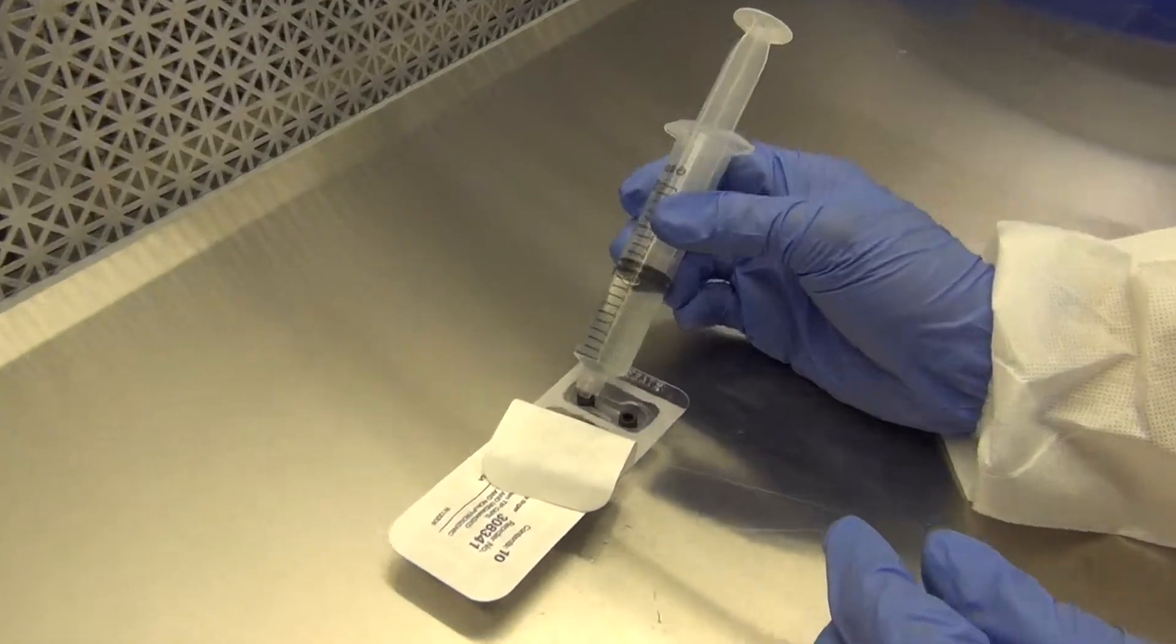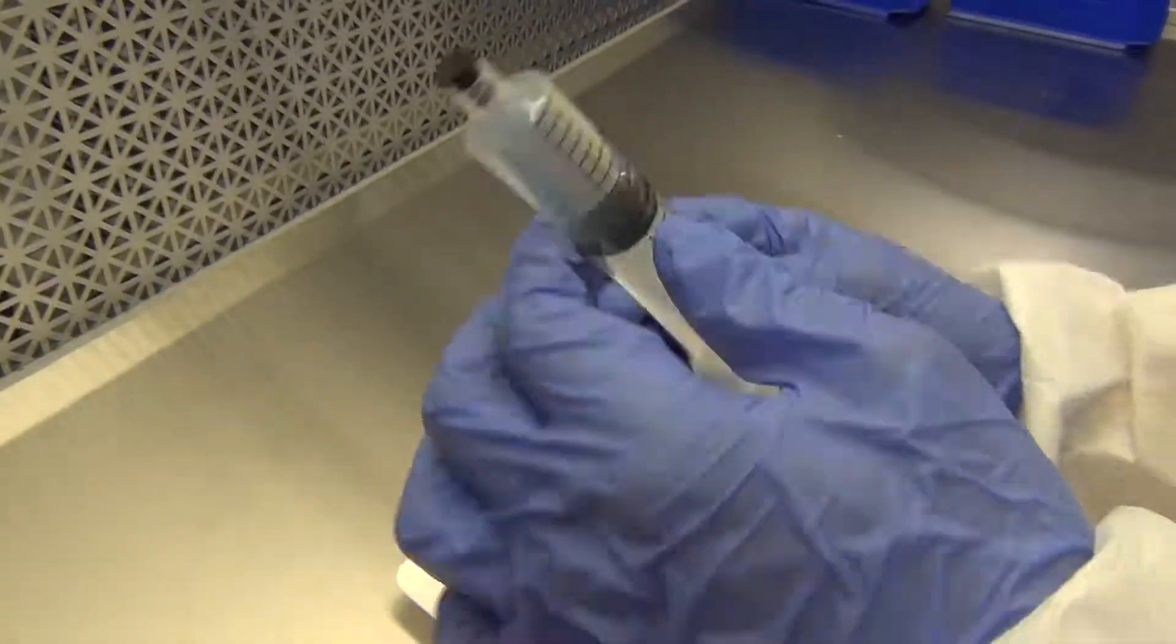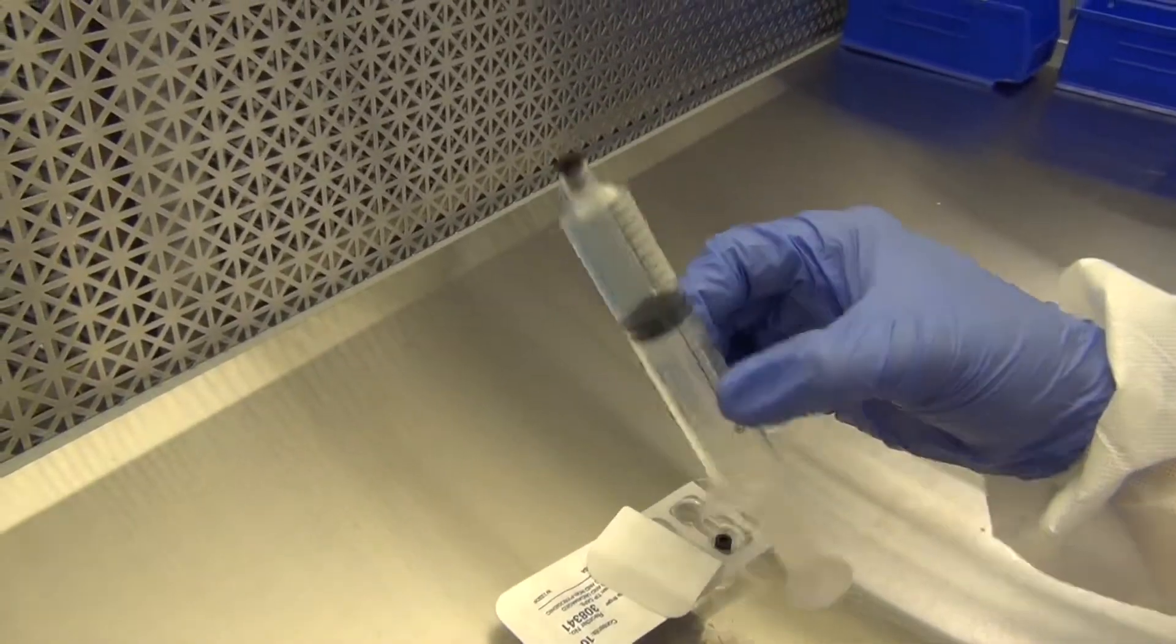Cap the syringe with the black syringe cap. This is your final dilution.